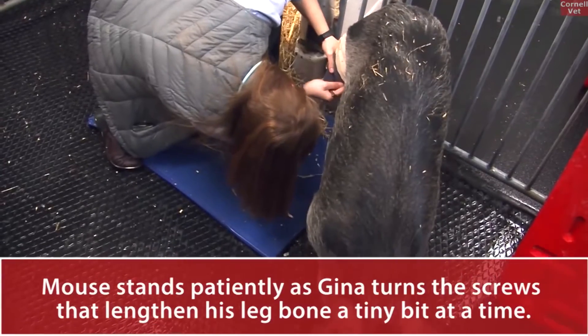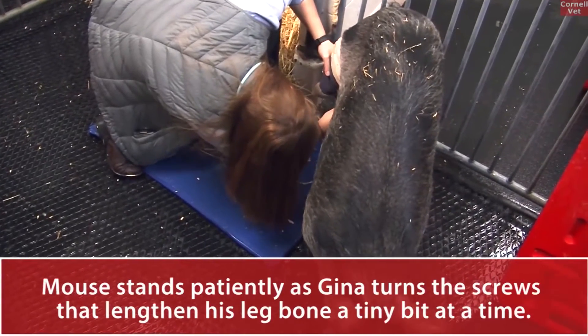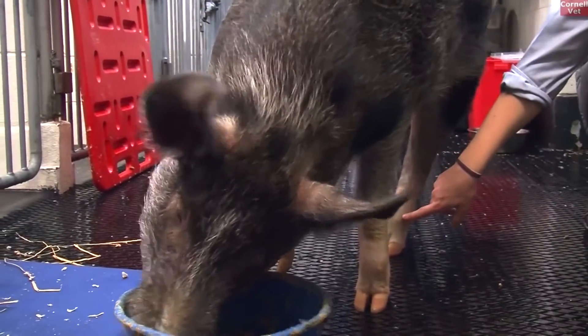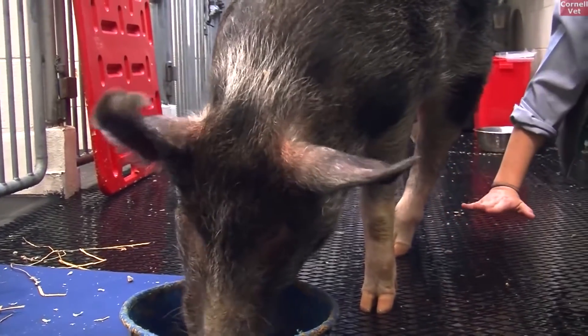Every day, multiple times a day, we just twist a bolt that increases the distance between the two pins, and that makes the leg longer. Once we know how much length we have, then we'll decide if we need to do the same thing to the lower part of the limb, or if we can add a prosthetic limb — whichever will be sufficient.